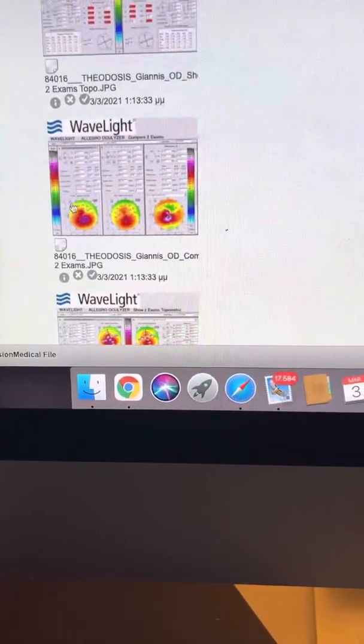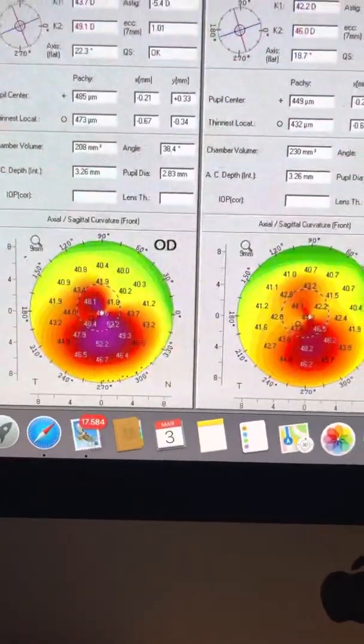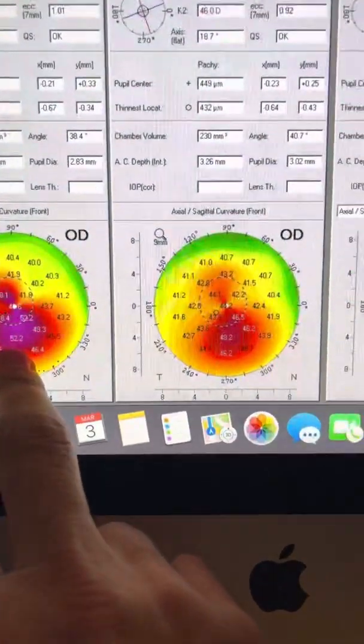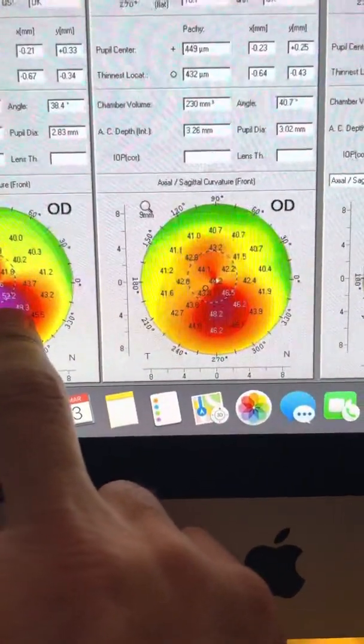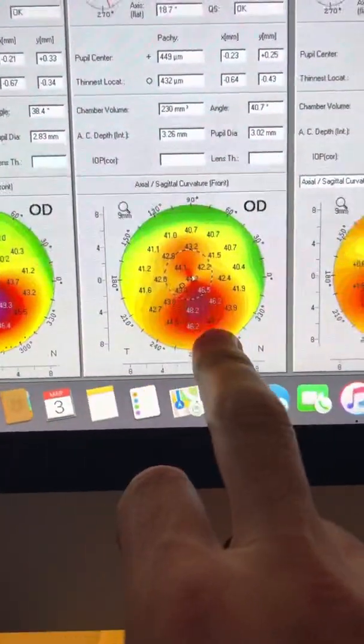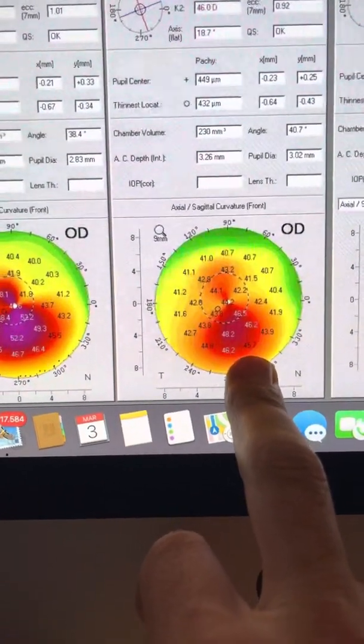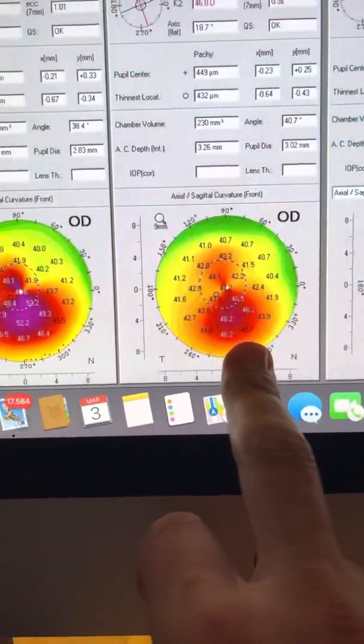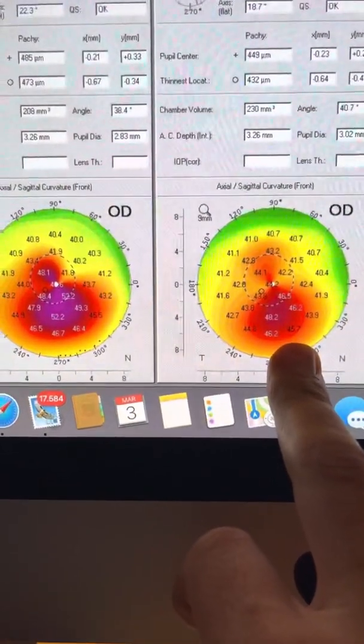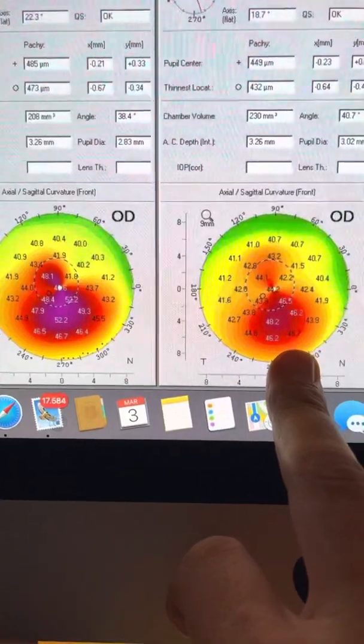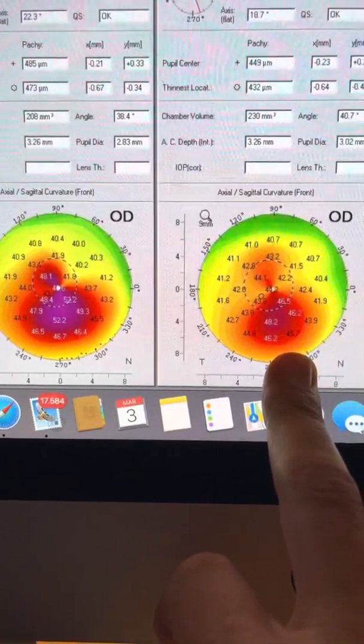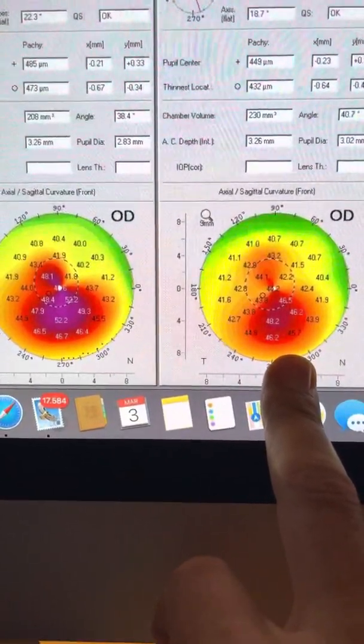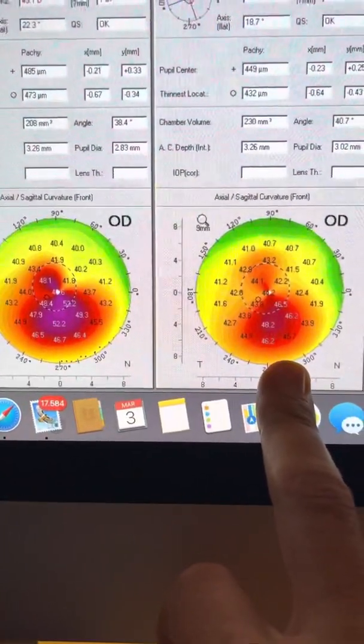which is pre-op and post-op here. So we're seeing his pre-op, steepest K at 53.2, and post-op here. He was treated November of 2019. We are in March of 2021, so we are one year and four months to be exact.